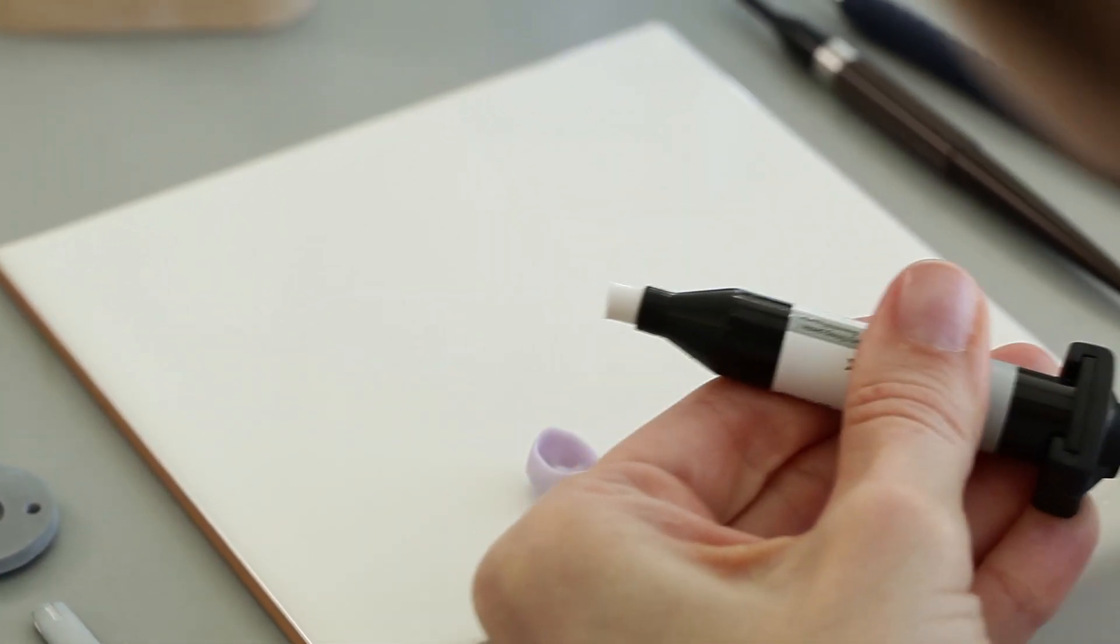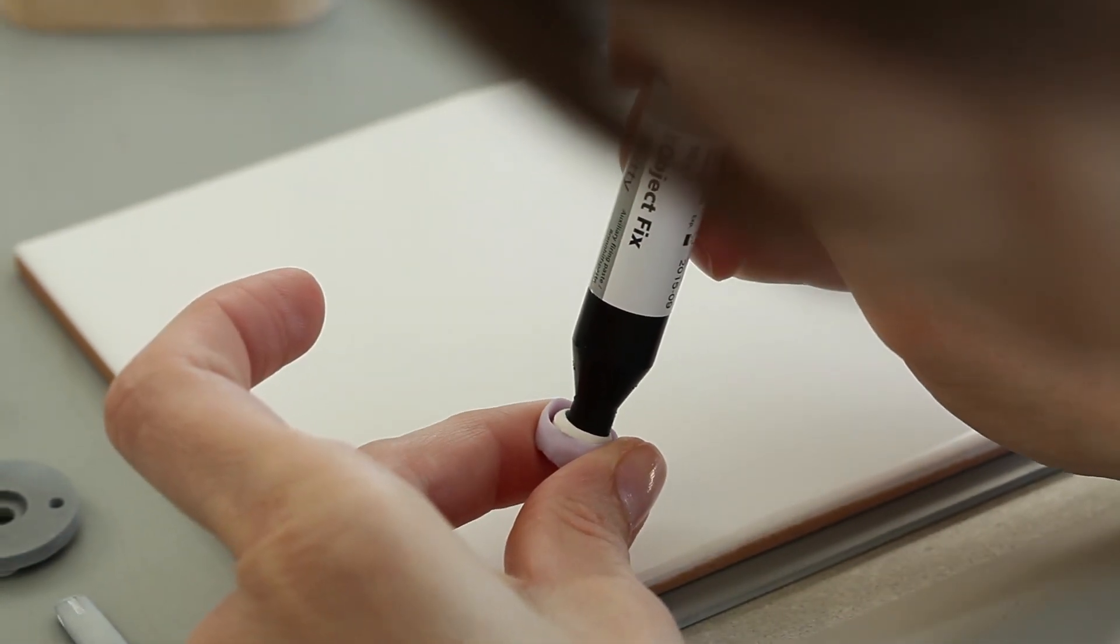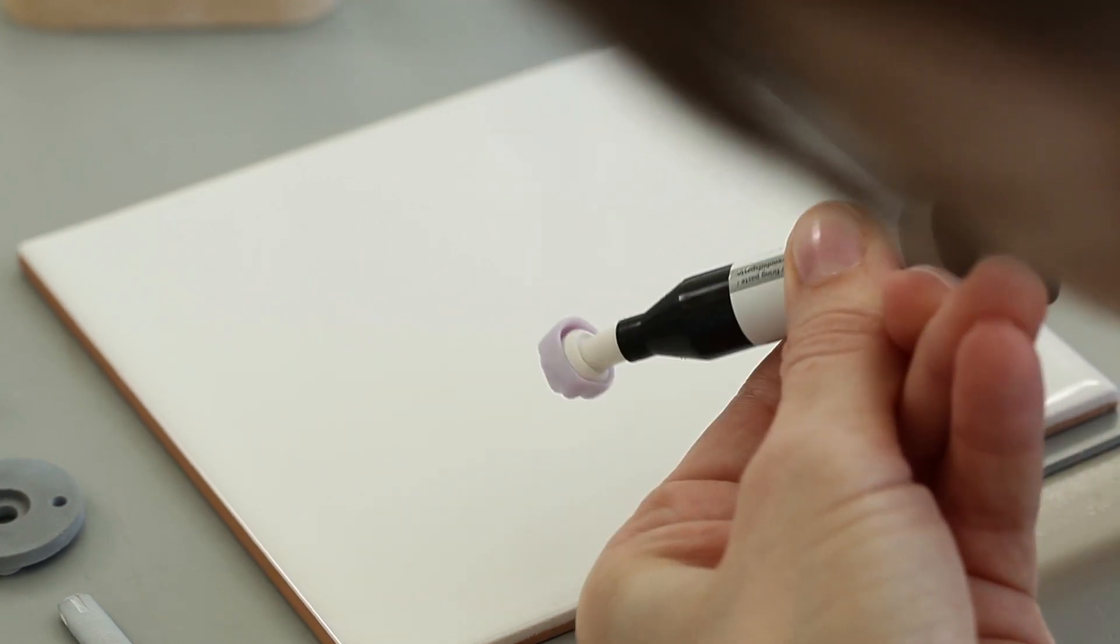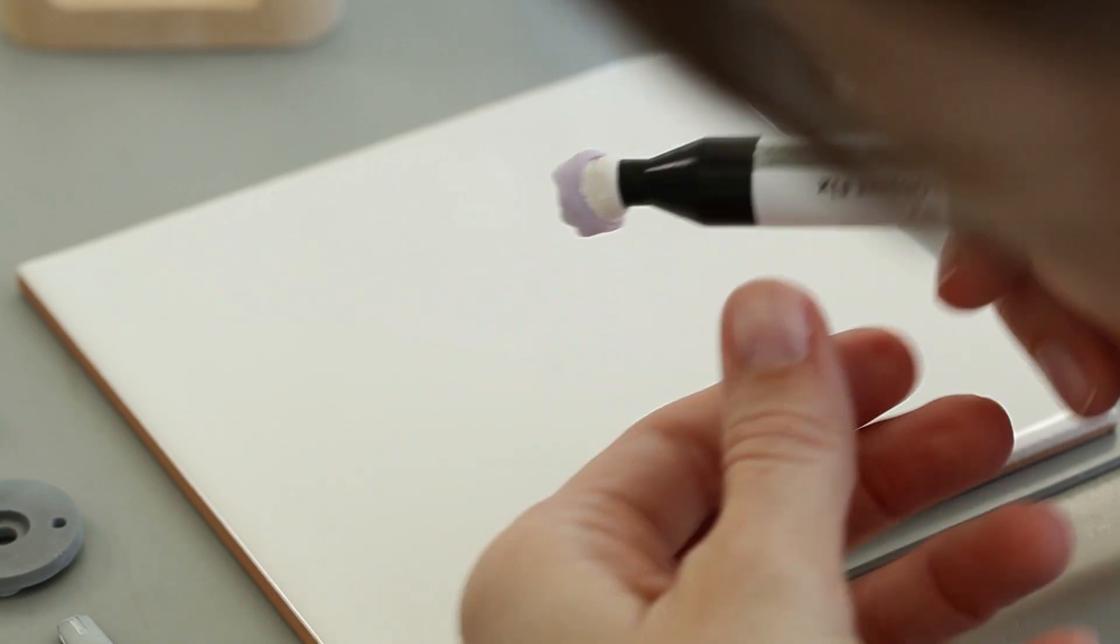Select the largest possible IPS Emax CAD crystallization pin. Fill the inside of the crown with IPS object fix putty or flow. Close the syringe immediately after use to prevent the material from drying out.